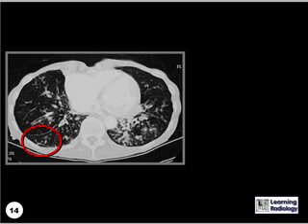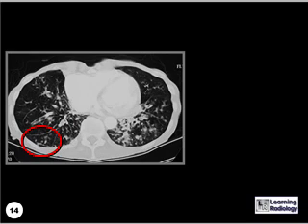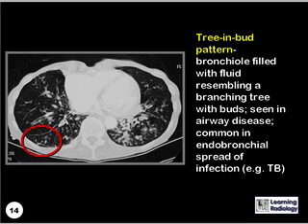What sign is demonstrated inside of the red circle? This is the tree-in-bud pattern, a bronchiole filled with fluid, pus, or the like, resembling a branching tree with buds. It's seen in airway disease and is relatively common in endobronchial spread of infections, such as tuberculosis.